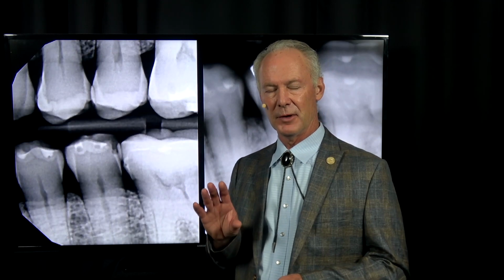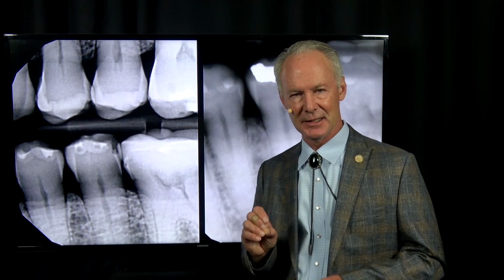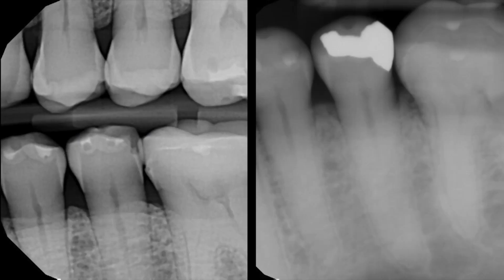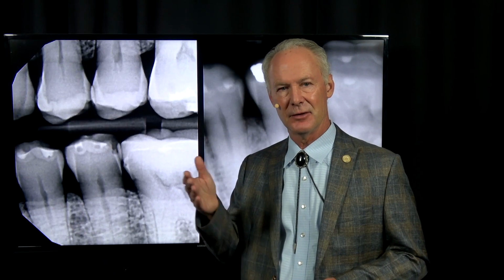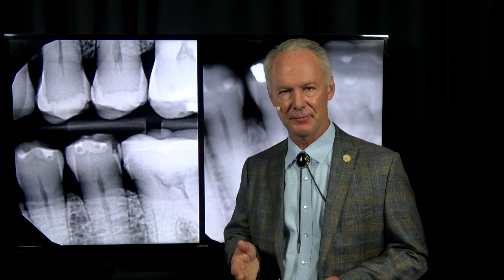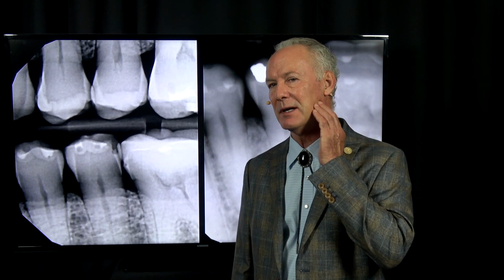Let's talk about one of my favorite restorations, gold inlays. In my opinion, there's nothing that dentistry has come up with that's more stable, stronger, and precise than a gold inlay or onlay or a gold crown. Many times I'll do full gold crowns on second molar teeth, where the big muscles are, right on top of them, because you don't ever have to worry about them breaking.